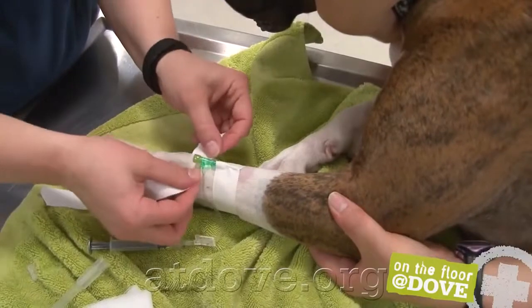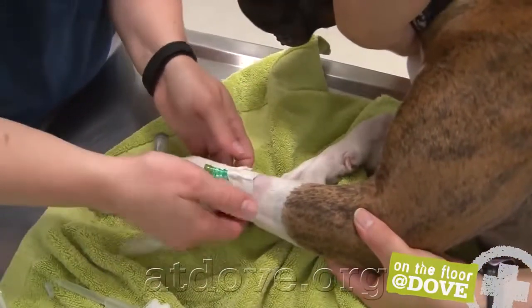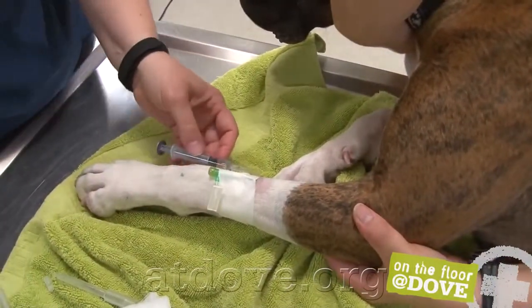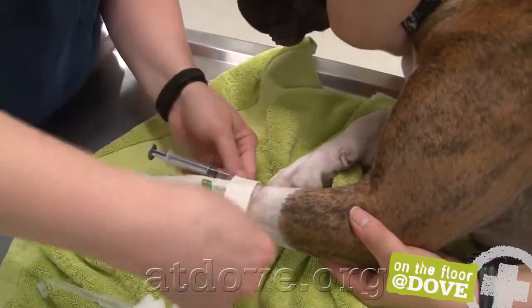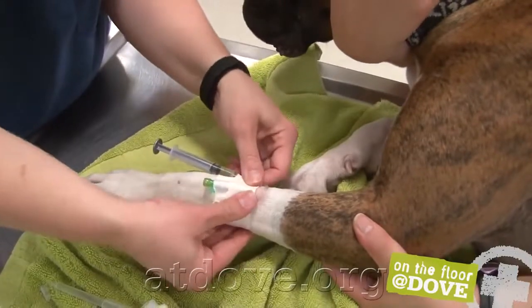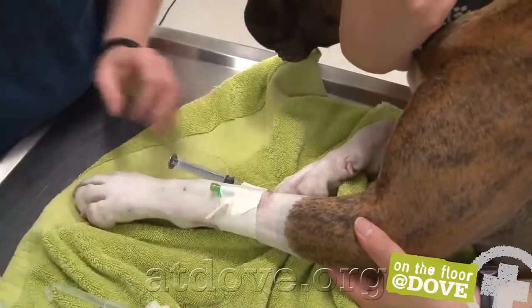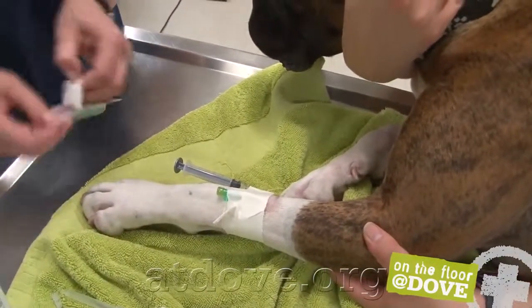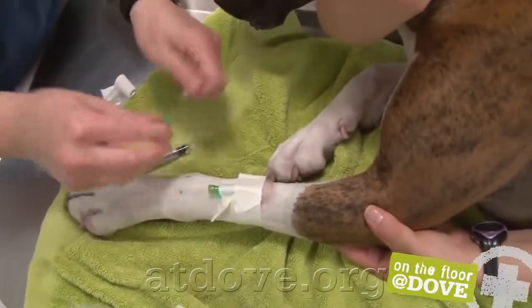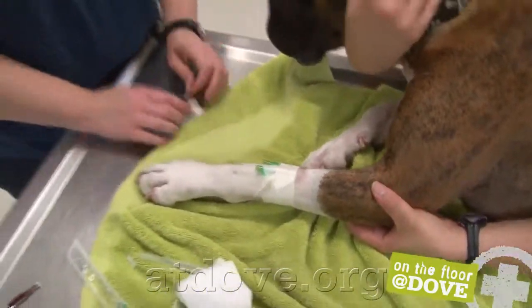My next piece of tape is going to slide under the hub of the catheter. Again, wrapping around the leg. I'm going to wrap the T-set around the top. One more piece of tape in there. I'm going to flush one more time. Everything's flowing nicely. I'll close off the T-set. Male adapter plug, and this catheter is ready for use. That's it.